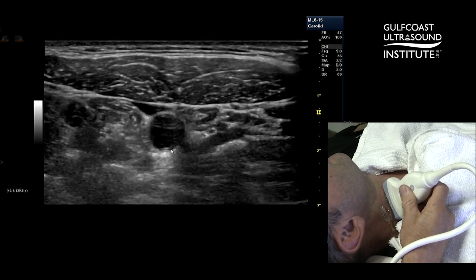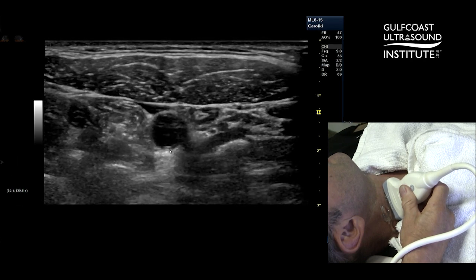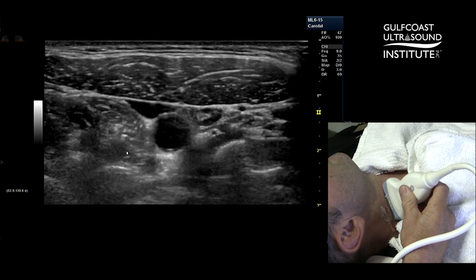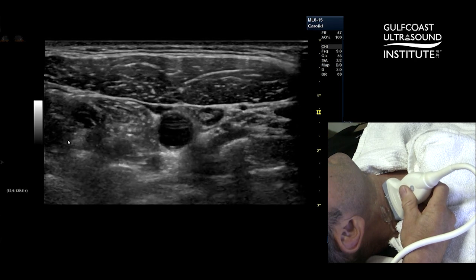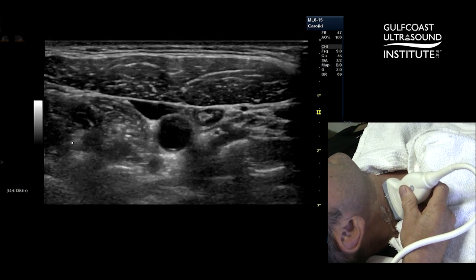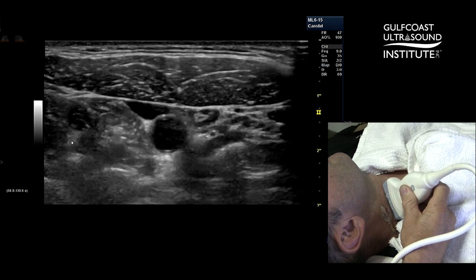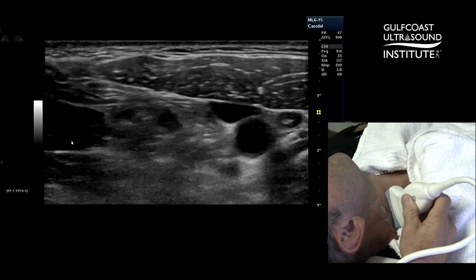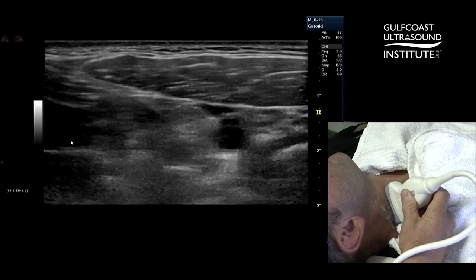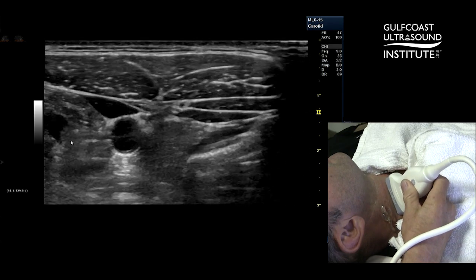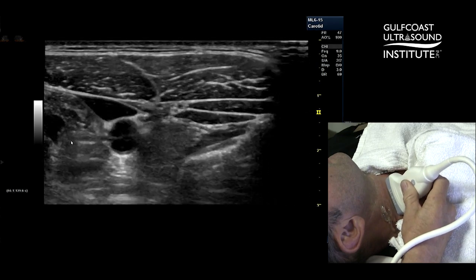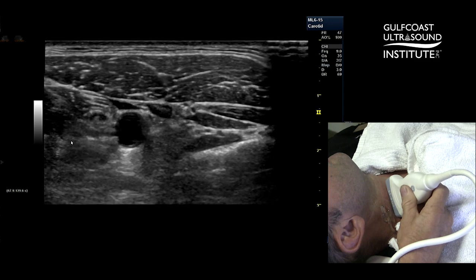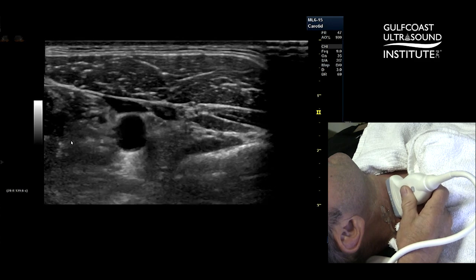Oftentimes this wall of the artery is called the posterior wall, but that's incorrect. If we're coming in from the side, this aspect of the screen is posterior. To demonstrate that, if you pull the transducer towards the back of the neck, you see more tissue off to the left of the field of view. The internal carotid artery bifurcates in the posterior direction 95% of the time.